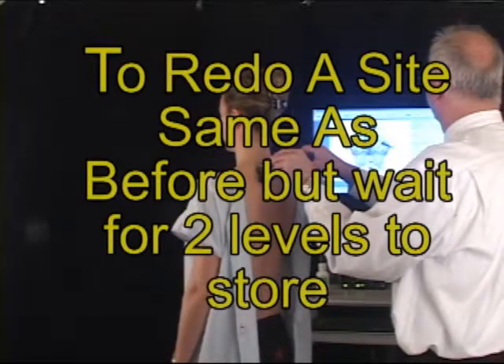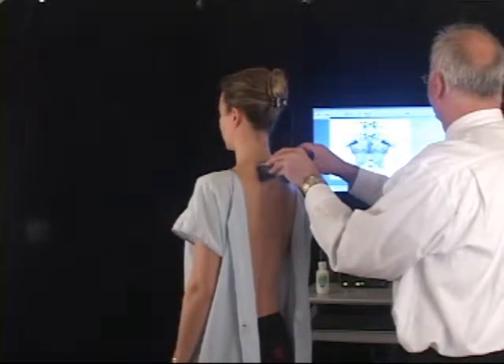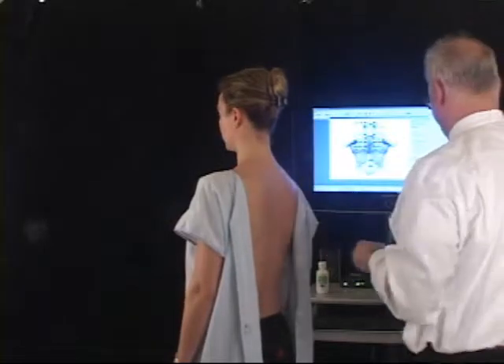If you need to redo a site, simply click on the level you need to redo on the screen with a mouse and you can perform the redo.